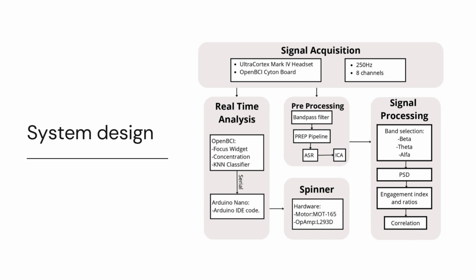Concentration data was sent via serial communication to an Arduino Nano. Concentration above 0.5 activates the DC motor, indicating a strong focus, while lower values kept it inactive. Simultaneously, the Arduino Nano processed data to control the DC motor's movement based on the user's concentration levels.